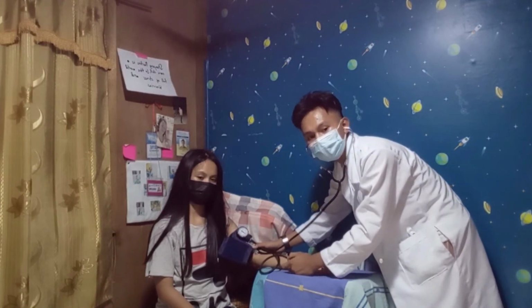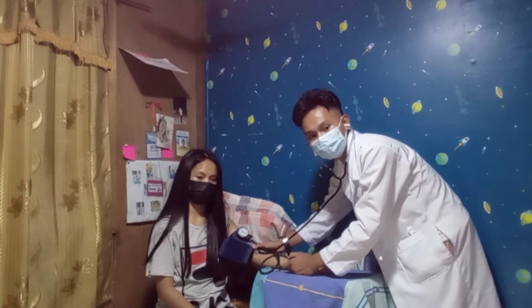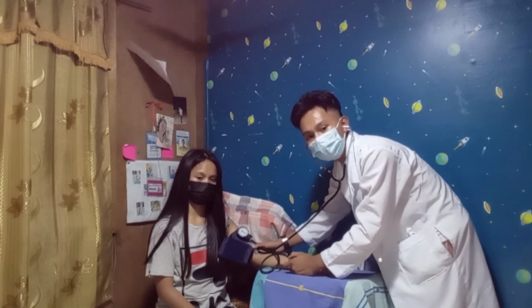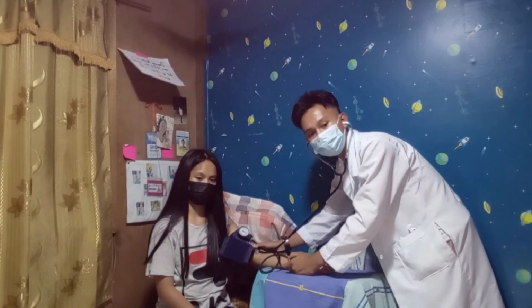Continue to deflate the cuff, noting the point at which sound disappears. Listen for 10 to 20 mmHg after the last sound, then allow the remaining air to escape quickly.